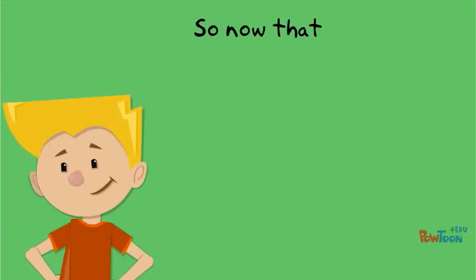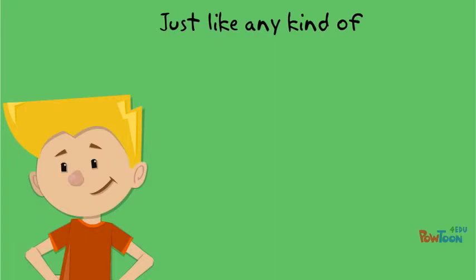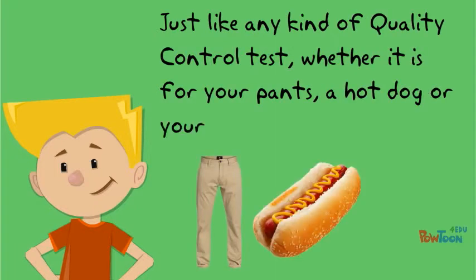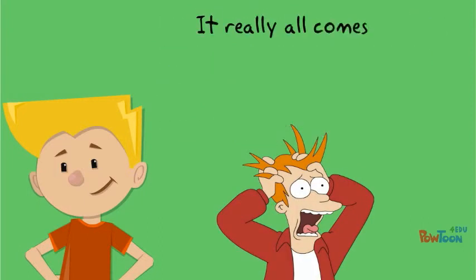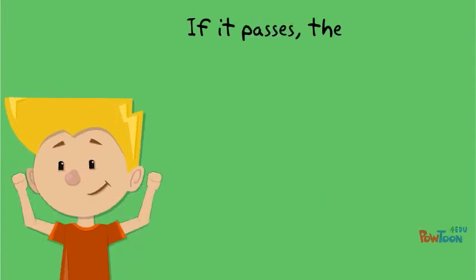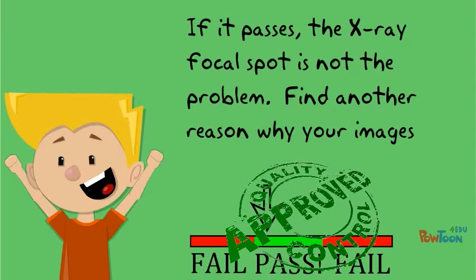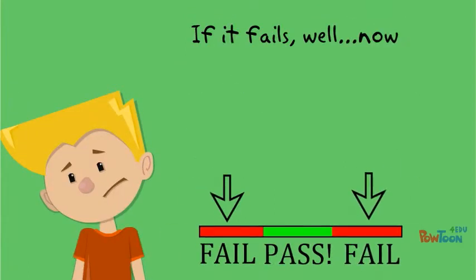So now that you've done your test, what do the results tell you? Just like any kind of quality control test, whether it is for your pants, a hot dog, or your final comp, it really all comes down to a simple matter of pass versus fail. If it passes, the X-ray focal spot is not the problem. Find another reason why your images are blurry. If it fails, well, now what?